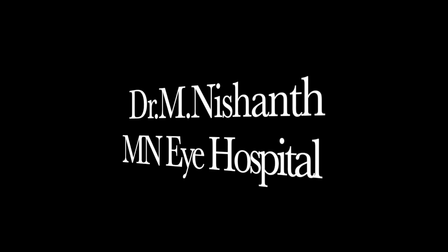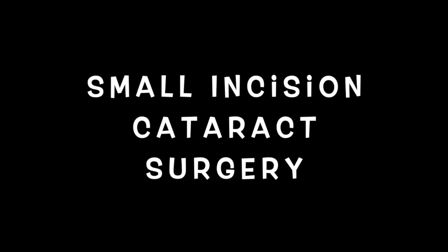Hi, I'm Dr. Nishant and I'm going to make small incision cataract surgery very easy for all.